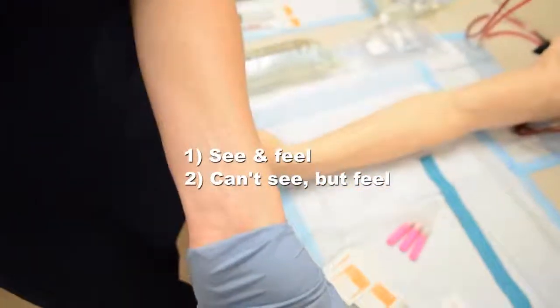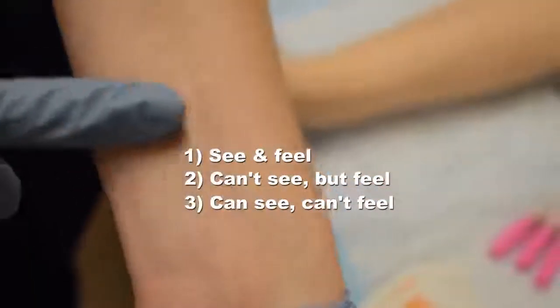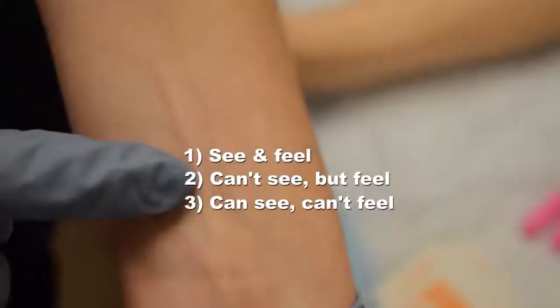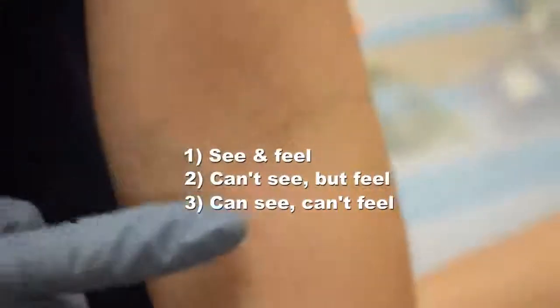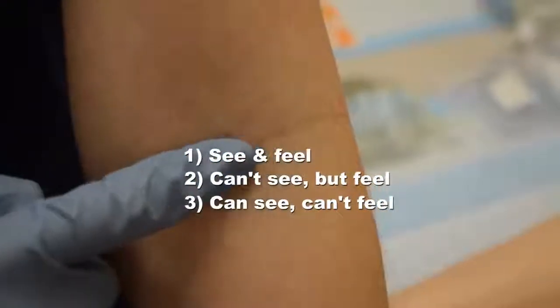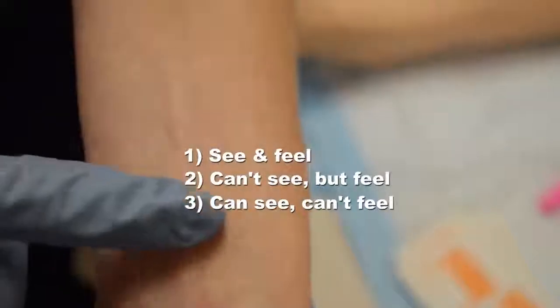The third type of vein that we would prefer, and our last choice, basically, is one that we can see but not feel. Those tend to be wrist veins or anything really in the forearm. Those are kind of our last-ditch effort if we can't see anything else, and they tend to take a smaller catheter size, such as a 22 or even a 24. So, ones that we can see and feel, ones that we can't see but we can feel, and then ones that we can see but not feel.